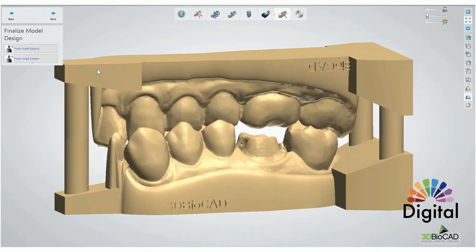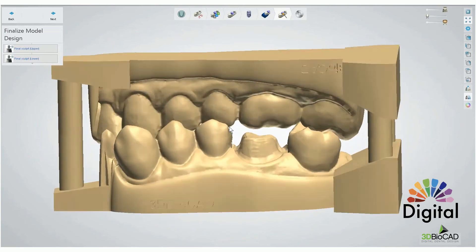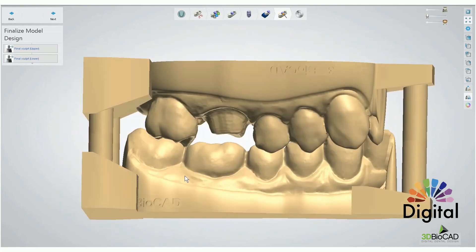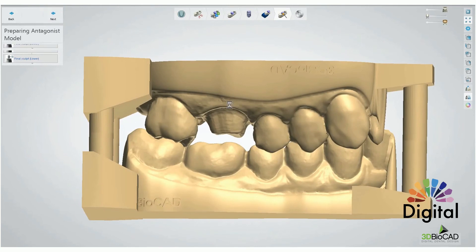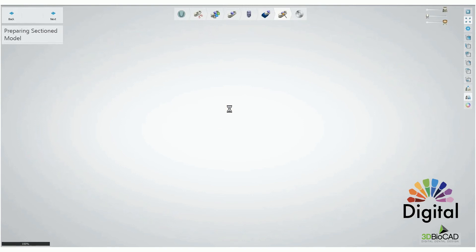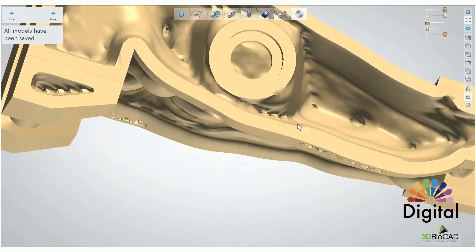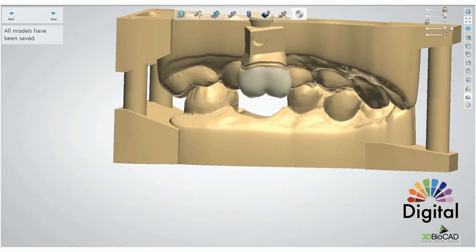We have just one more step: Finalize Model Design. Same thing — if you don't need to do anything here, we don't have to. Click next and the software will finalize and save your model. The crown is already done, so the crown design is already saved. Once your crown design is done, the crown file is automatically saved as an STL. If you do Model Builder too, you will have both a crown file and a model file — so you can print the model and mill your crown. We have a die and crown.